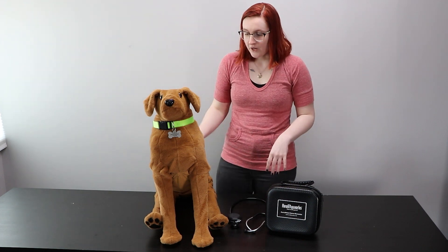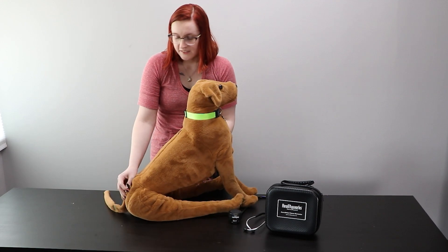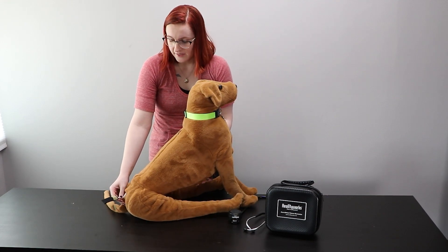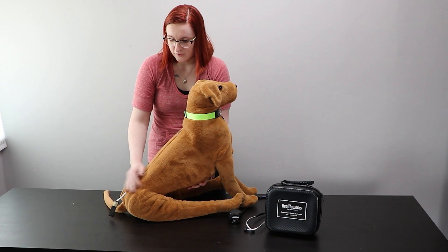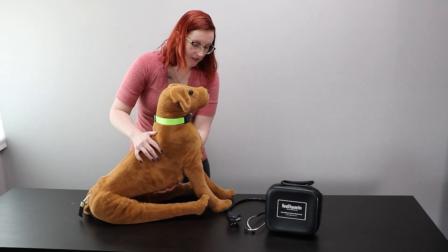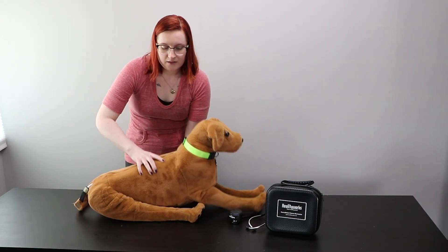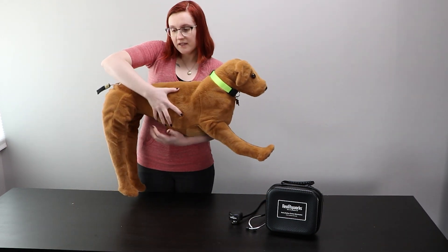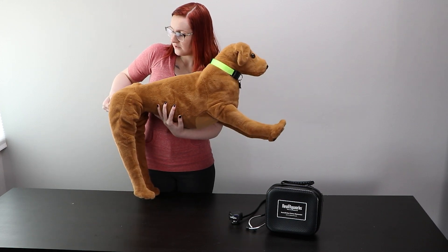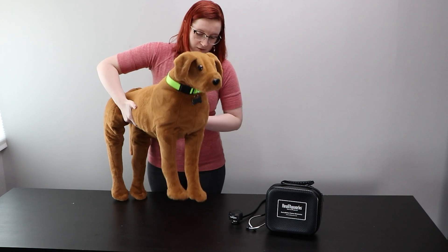But auscultation isn't all this trainer can do. You can also practice restraint holds as it has very removable limbs. It has a rope by its tail that is in a locking mechanism for sit and stand positions. If you want it to lay down, you pull it out of the locking mechanism and maneuver it into a lay down position. And then if you want to move it back into sit or stand, you pull the rope tight and back into the locking position.